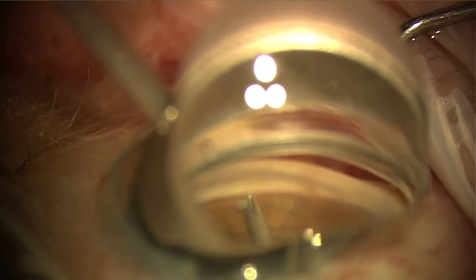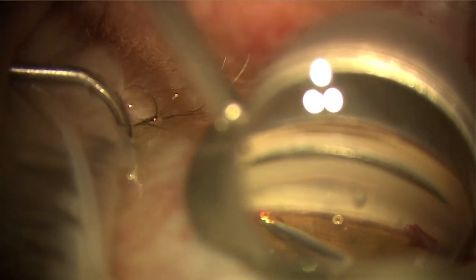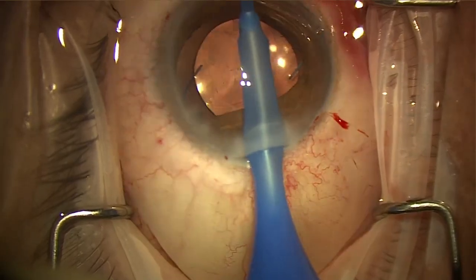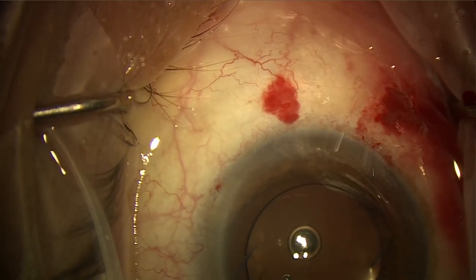And there is the third stent going in now. We're using the Healon cannula just to check the position of the stents and make sure they're in the right position. And in this case, we're now going to inject some BSS into the anterior segment, and we see excellent blanching of the nasal collector channels. And that concludes the case.